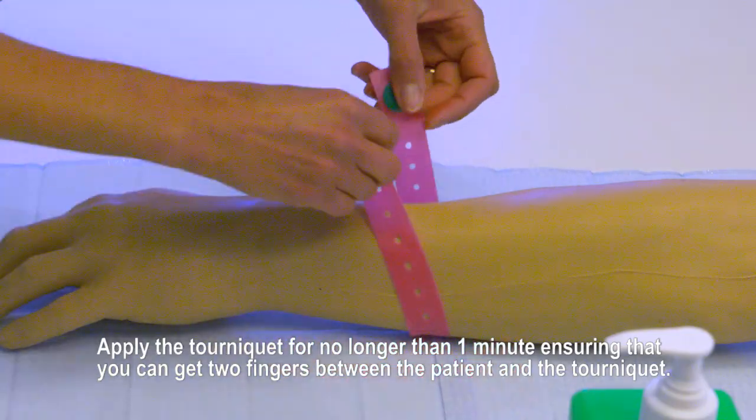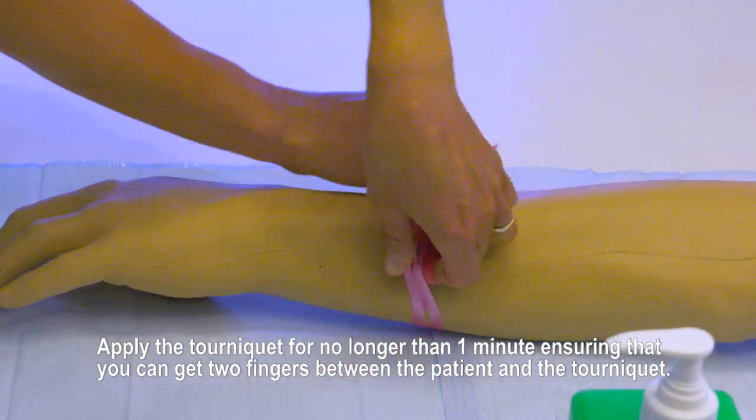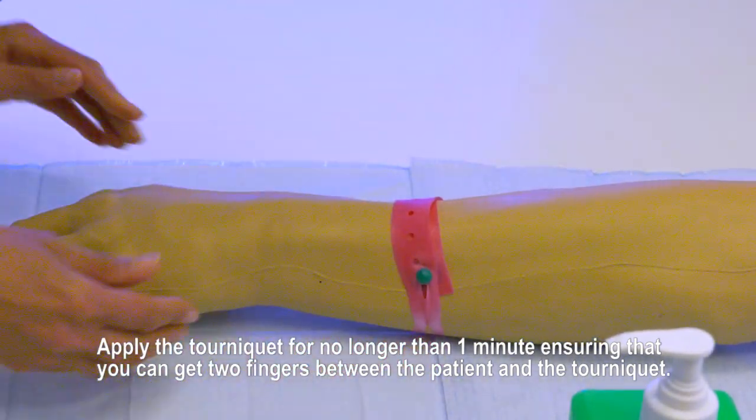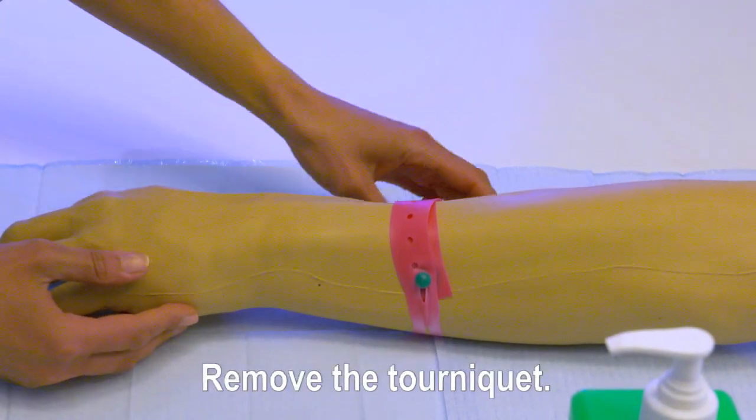Apply the tourniquet for no longer than one minute, ensuring you can get two fingers between the patient and the tourniquet. Assess the vein, then remove the tourniquet.